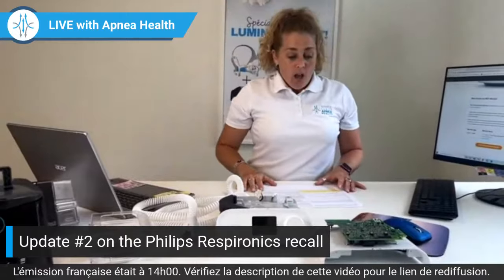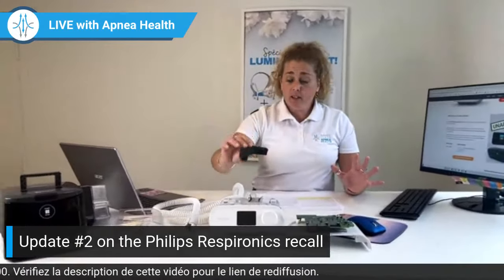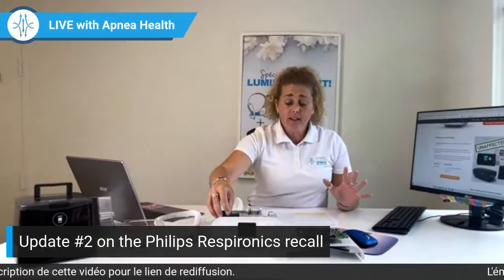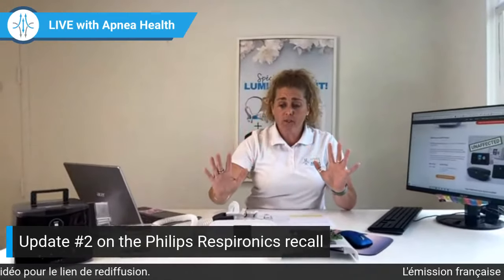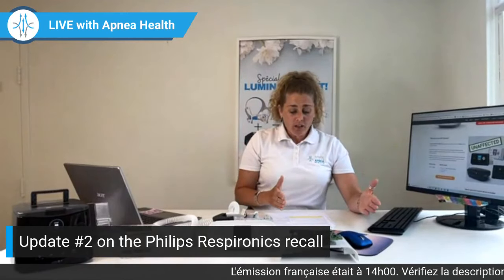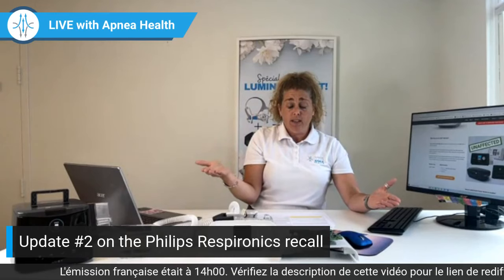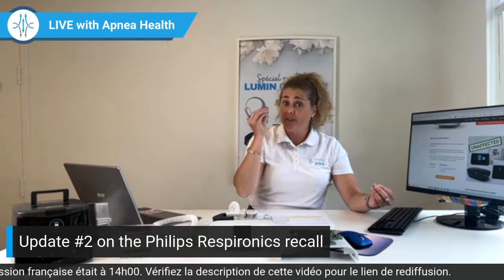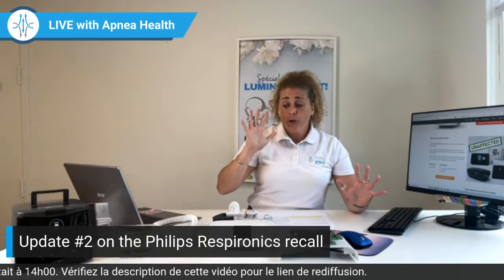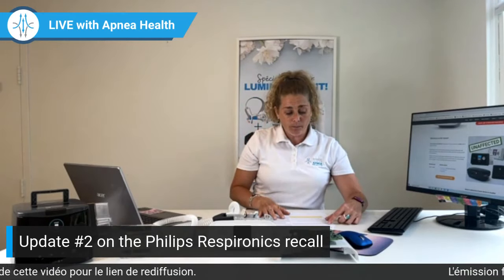So now let's take a look. Okay, we see how this is good. The foam is in perfect shape. It works fine. There's no damage whatsoever on it. So if we take a look, have you used ozone? If you have, you need to check your things. You need to check your CPAP accessories, and I'll show you how.